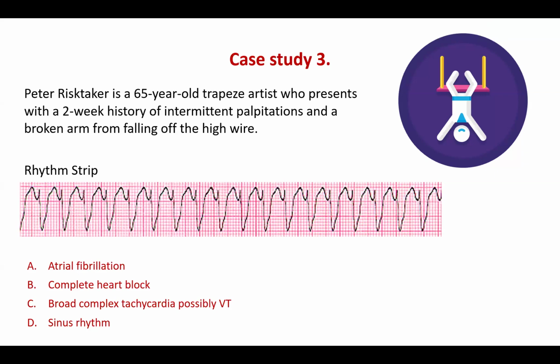Yeah, sorry, Glenn. Go. So if I was looking at an ECG, I would just look at all those leads because I want to see all the views. I want to see the inferior views, the anterior views, the lateral views, because all those make sense in terms of you want to see if there's any areas of ischemia or infarction.